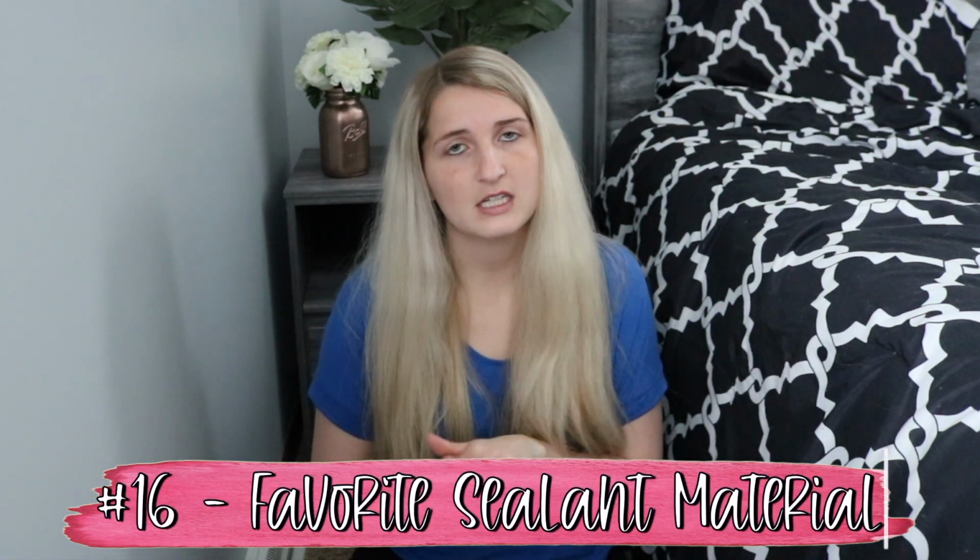Then at number 16 is sealant material. So my favorite sealant material is the Ultradent Ultra Seal XT Hydro. I love that it's a fluoride releasing composite sealant. No matter what, I would always want to use a fluoride releasing sealant material. I found that it is really strong, it has a high retention rate, it's BPA free, and one of my favorite things about it is that it's really forgiving whenever it comes to moisture and the deep pits and fissures.